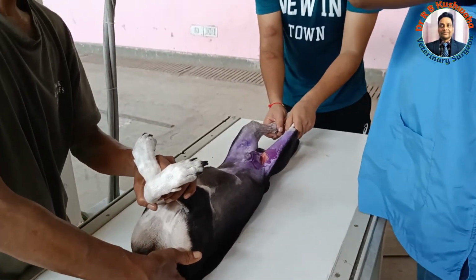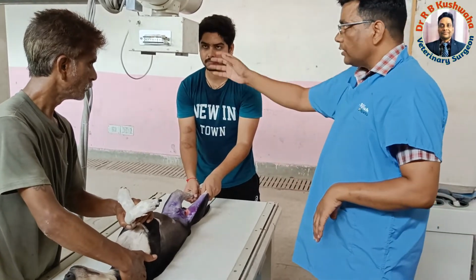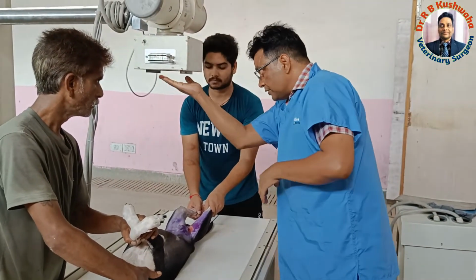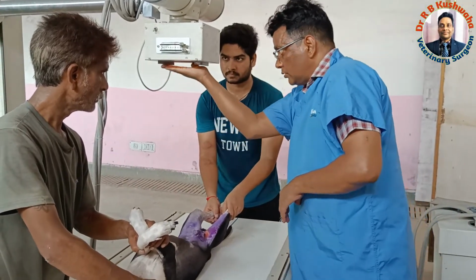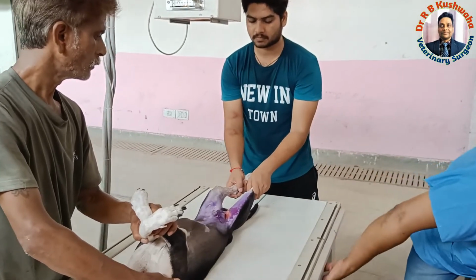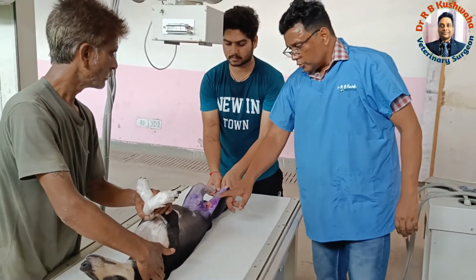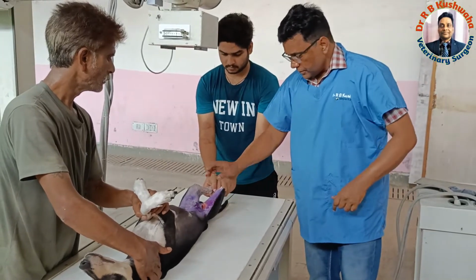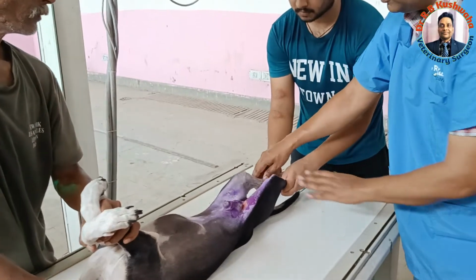Now there should basically be a dim, subdued light, but here since the light is removed, it is difficult to align the center point and center ring. Okay, now this is okay. Although the animal is in ventrodorsal position, for the femur bone it is actually the AP view.